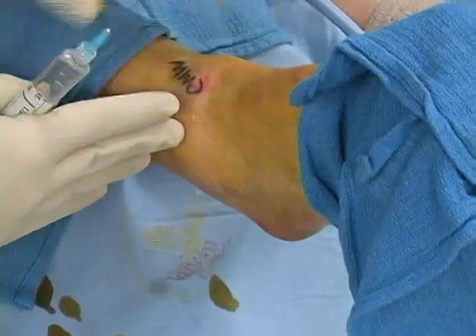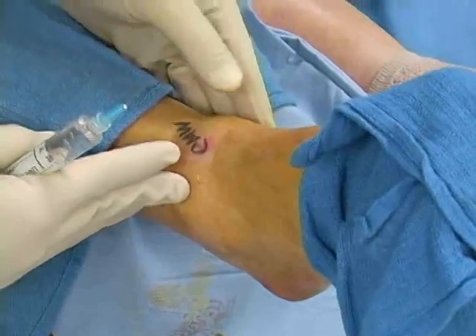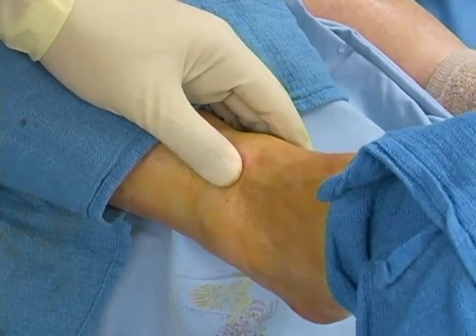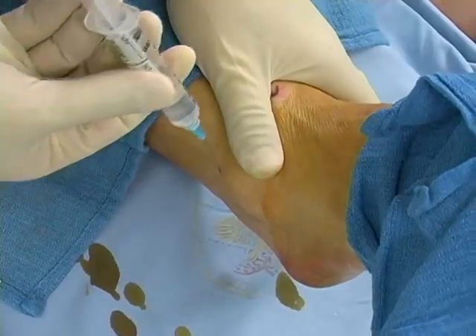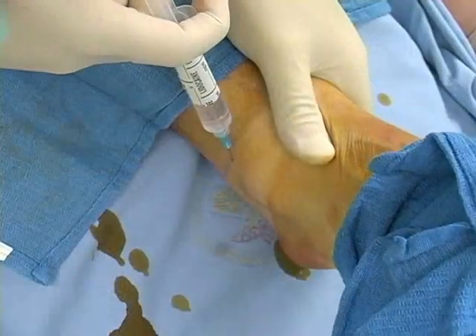The last nerve to be blocked is the sural nerve. Facing the lateral side of the ankle, identify the lateral malleolus and the Achilles tendon. The sural nerve runs in the superficial tissues approximately one centimeter posterior to the malleolus. Insert the needle at the border of the tendon at the level of the malleolus.